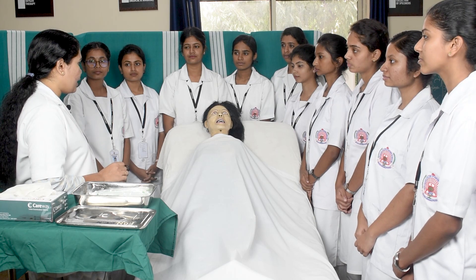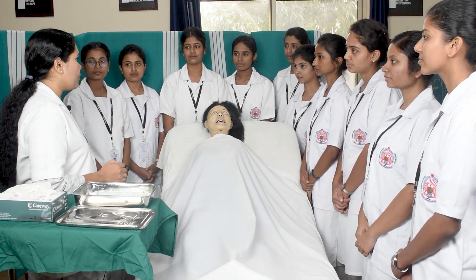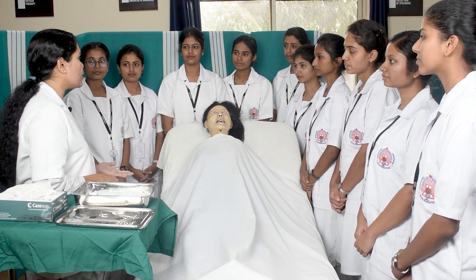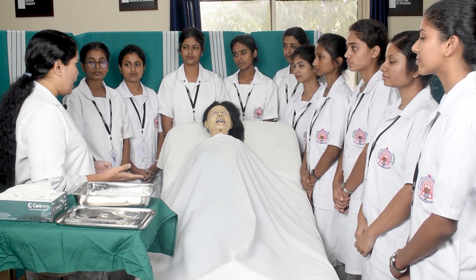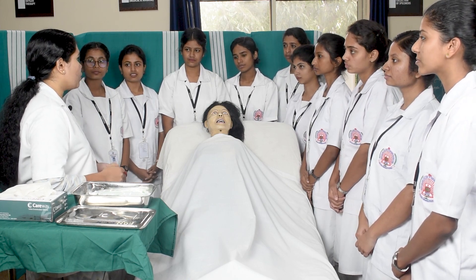We will be introducing the ryle's tube for two main purposes: first, to provide feed to the patient who is not able to take oral feed, and second, to allow the drainage of gastric contents in case of drug overdose or poisoning.